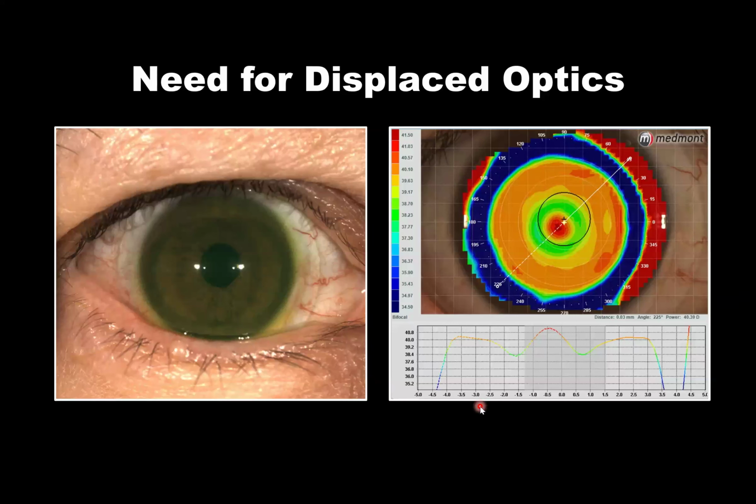Lo que queremos decir con esto es, en un lente escleral multifocal, el poder se pone en una zona óptica en la parte frontal del lente. Y entonces cuando usted hace una topografía, va a notar claramente la diferencia entre la área central, que pudiera ser de centro lejos, centro cerca, dependiendo del multifocal que usted utilice, pero se va a notar esa área.